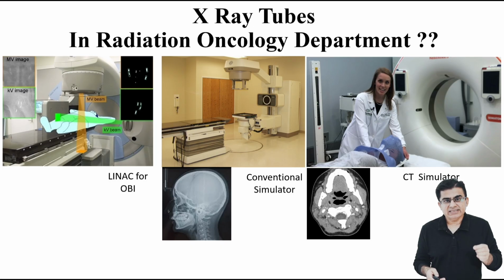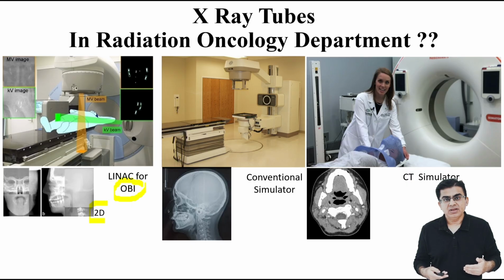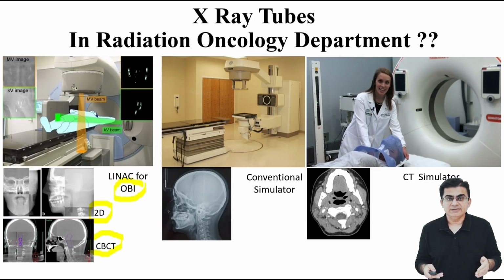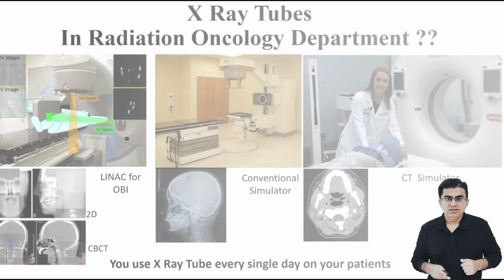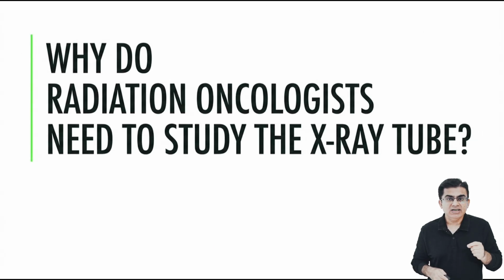You use this exact X-ray tube every single day to take your orthogonal 2D images. You also use it every single day to take your CBCT, cone beam CT scans. You rely on this tube for all of your image-guided radiotherapy. Do not ever make the mistake of thinking you do not need to understand the X-ray tube. You use it every single day on your patients. If you do not understand exactly how this X-ray tube works, you do not truly understand your own linear accelerator. Let us understand this.